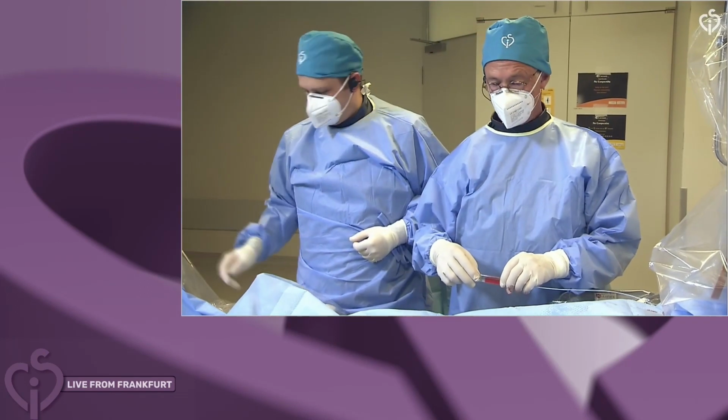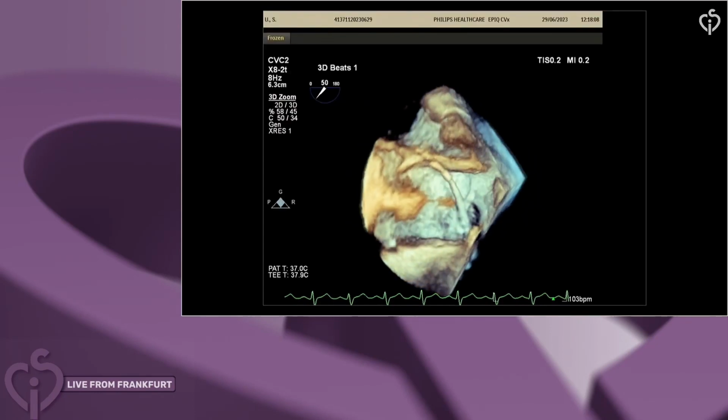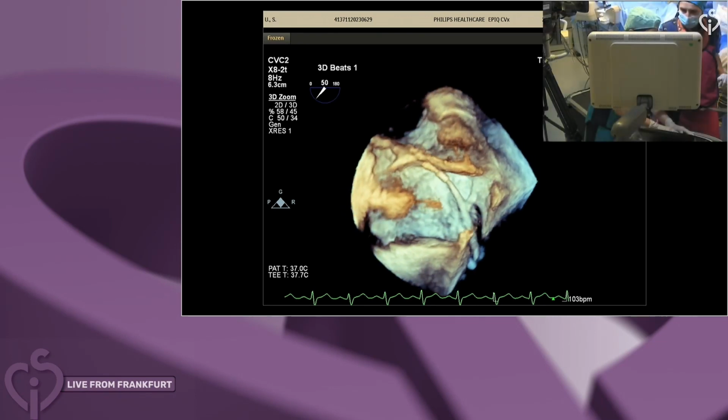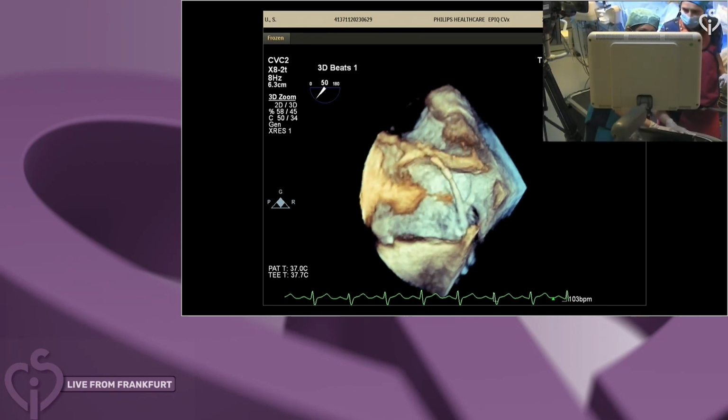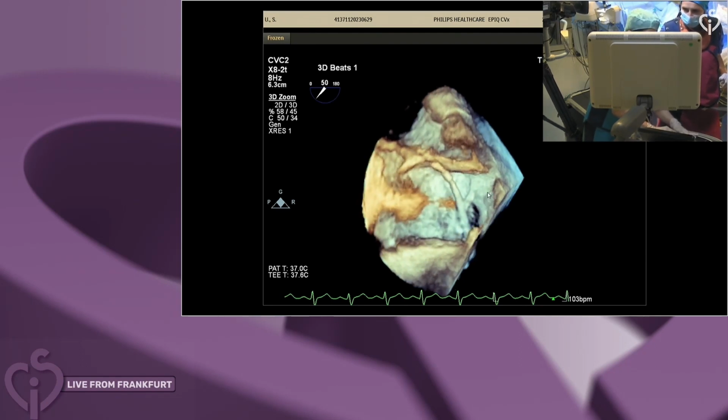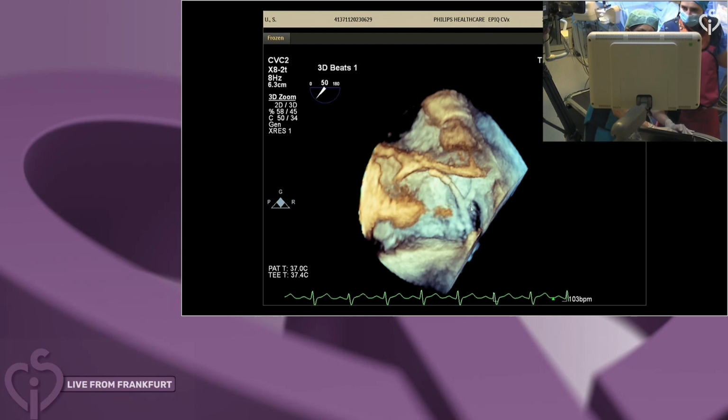Actually, we've got the 3D image just in front of us right now. This is the left atrial view. There isn't time to do cropping, I'm afraid, so I can't make the picture look a bit nicer. But you can see the wire's already through the PFO. There's the PFO opening. We've measured that at about 12, 13 millimeters. And you can see that there's no tunnel. The top of the fossa is here, so there's no tunnel.